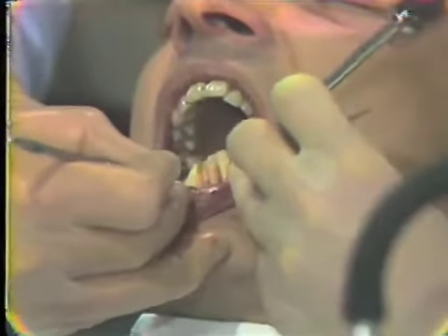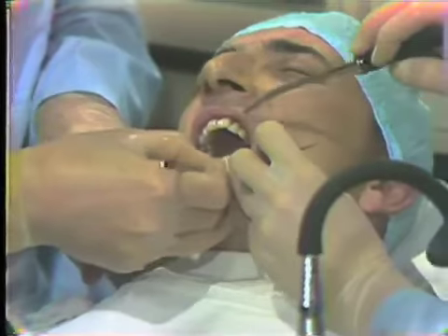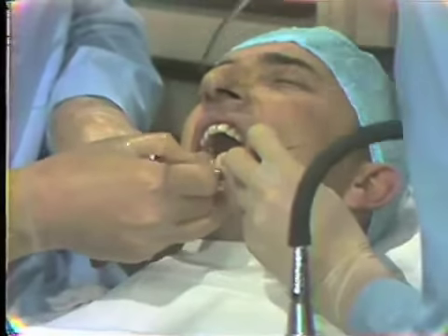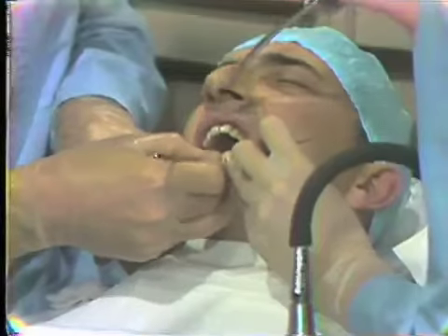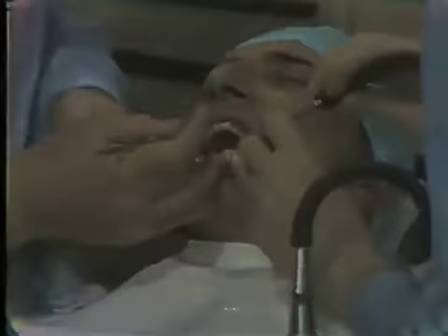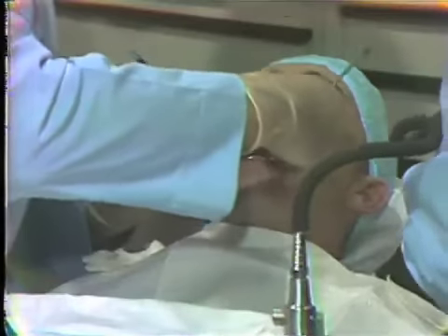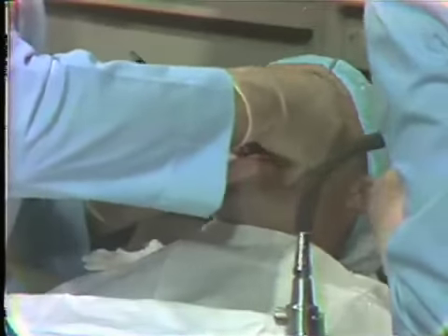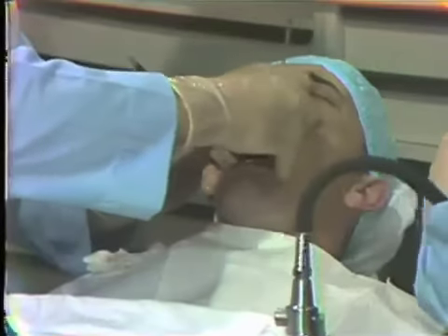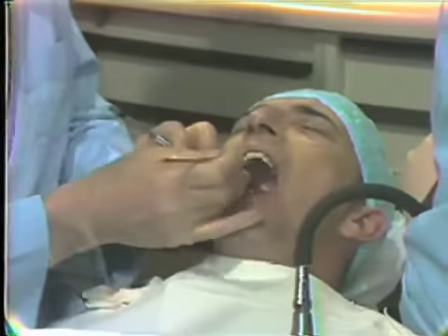Move the retractor here for me now, please. For a final checking then of the root surfaces from the lingual aspect. Periodontal probe, please.